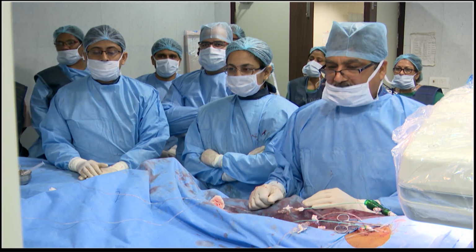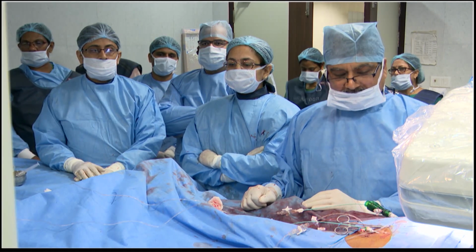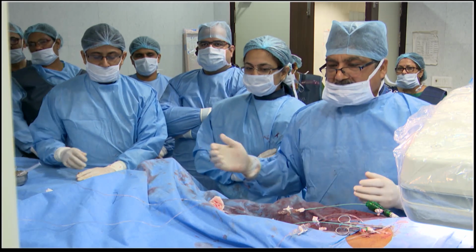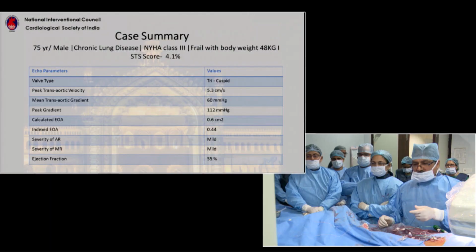So welcome to Lucknow, and this is the case that we are doing. It's a TAVI case that I have planned. And with me is my team. Dr. Rupali is there, Dr. Manik is there, Ankit is there. We have done some things, and I'll show you the case. Can we see the case?